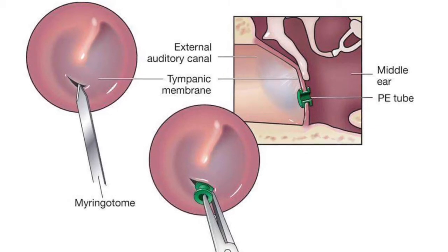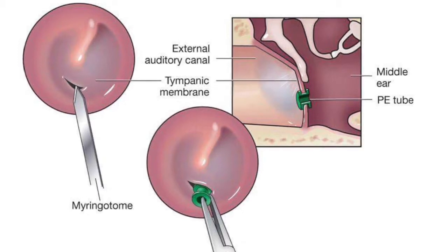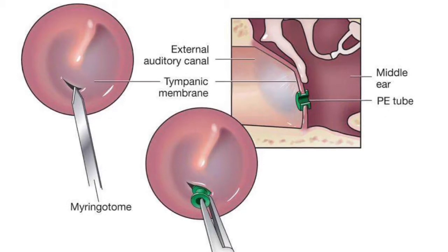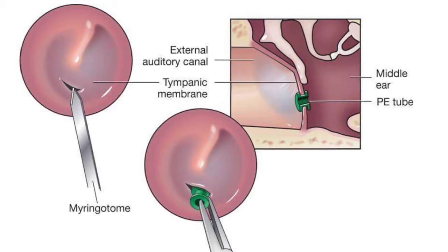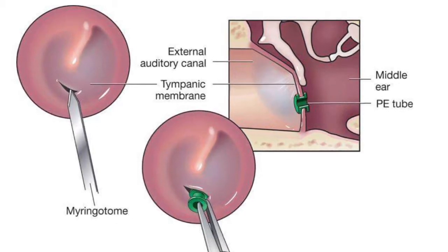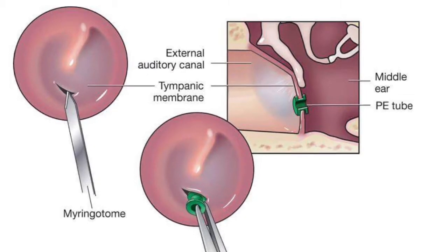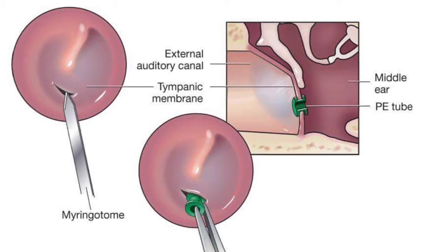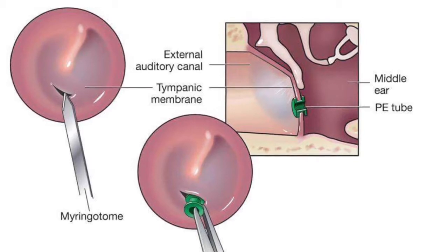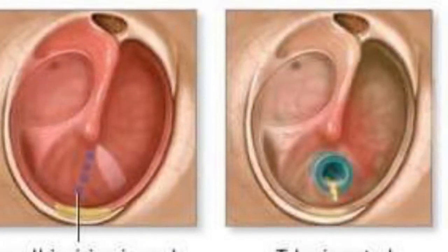Diagnostic tests include clinical examination of the external auditory canal, auricle, and surrounding tissues for signs of infection, inflammation, neoplasm, scars, or lesions. Otoscope is performed for the initial examination of the tympanic membrane. Cerumen is removed as necessary to allow complete visualization of the tympanic membrane.